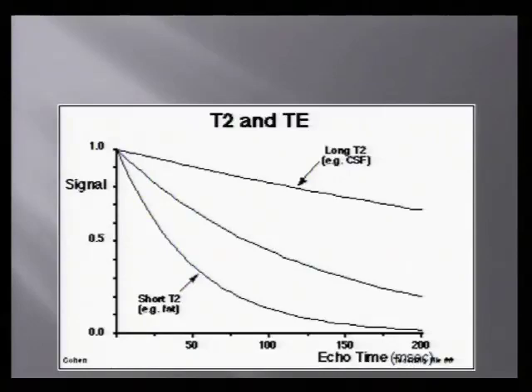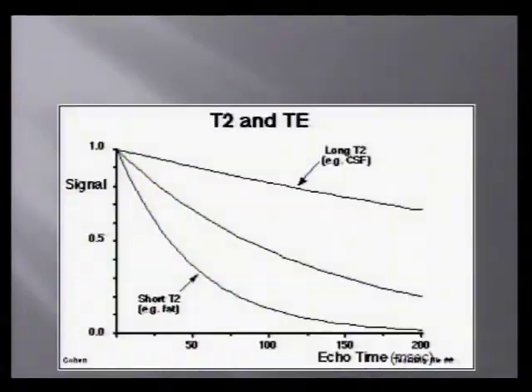Again, the only reason I'm going through this is just to briefly show you MR isn't just like CT where you just do it to get an image and it's going to just basically be based on density. What you're doing with all these parameters significantly alters the way the image is going to look and gives anatomic information about what's actually there, because we know water dephases very slowly, so if you lengthen your TE and you see signal there, it suggests to you certain characteristics. Now keep in mind, it's not as simple as just water or fat. Every element or every molecule has its own physical properties, also depending on what lattice it's in. But clearly, there's a large amount of information you gain by just understanding these concepts and how you're altering your scanner to take full advantage of them.